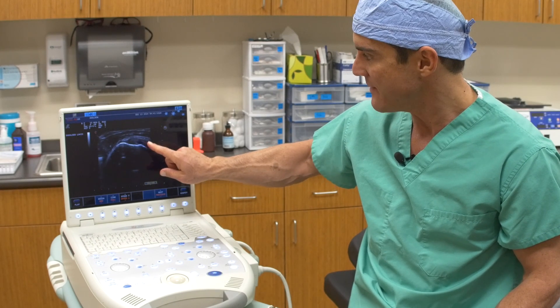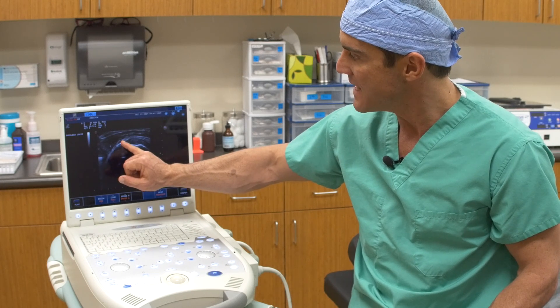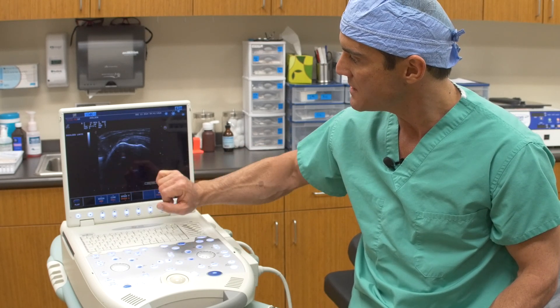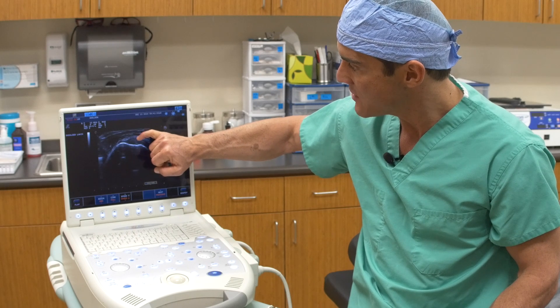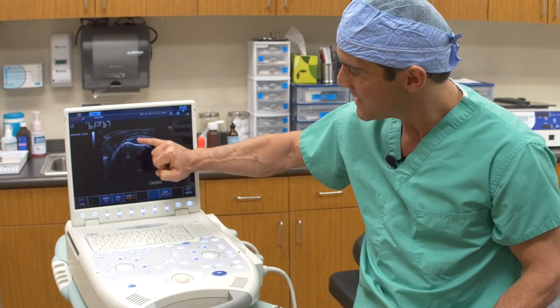When you have a tear — this person does not have a tear — but if you were to have a tear, sometimes it would be at the end where the parrot's beak would be blunted. Sometimes you can see a tear right down through the center, a transverse tear. Sometimes it's a linear tear.